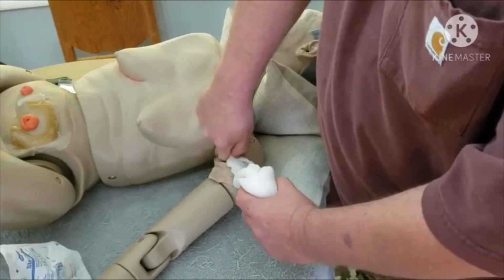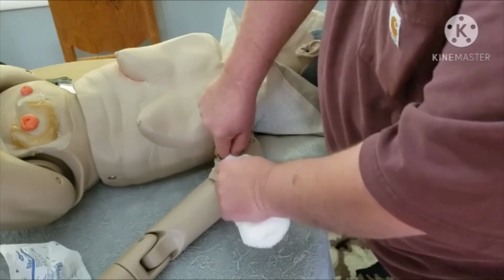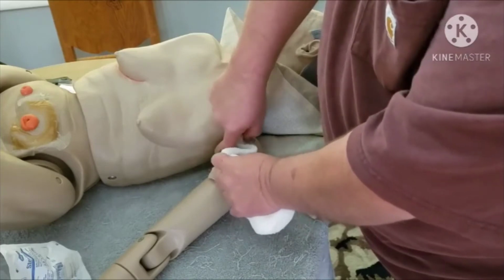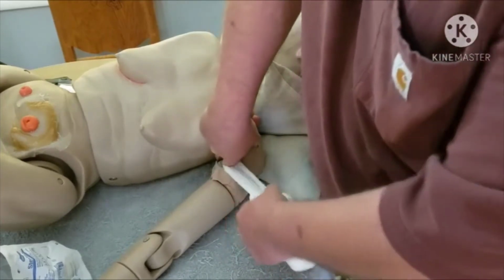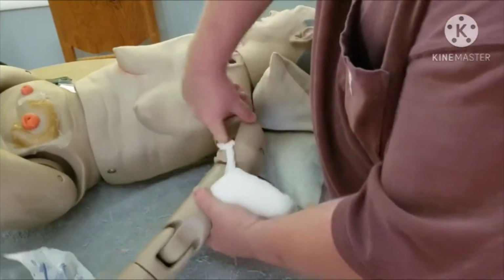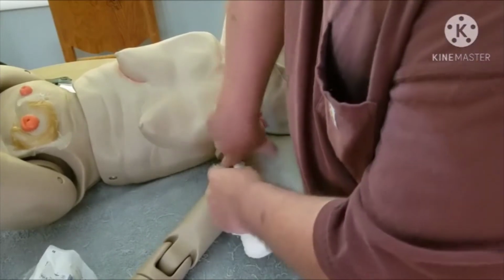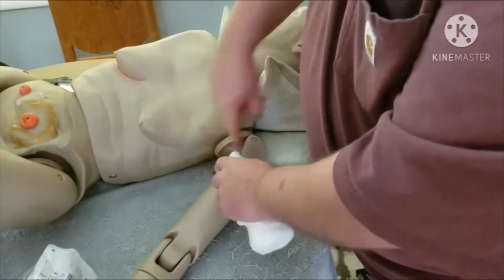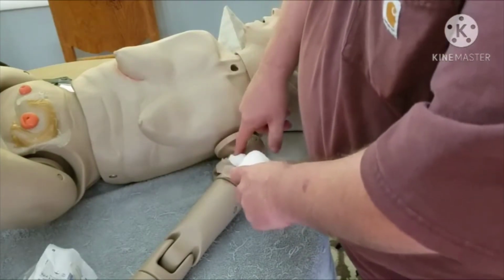Then you pull your finger back out, and you're feeding yourself with this hand. So I'm feeding some more gauze over here over top. And as soon as that finger comes back out, I'm pushing it right back in there again. And then I'm feeding myself another piece, and I'm right back in again. And the whole idea is to try to maintain that pressure down in there as much as you can, and just keep feeding yourself. And my wound is falling apart here because I kind of had it cobbled together. But you get the idea.